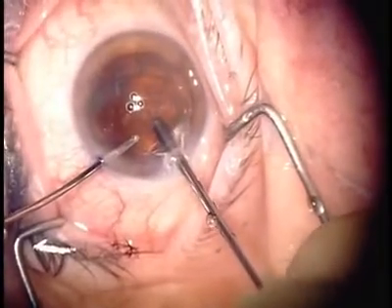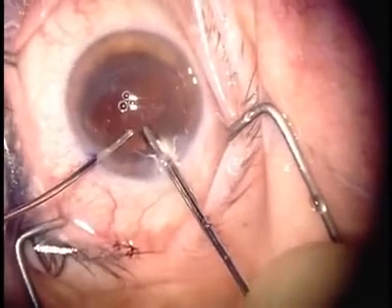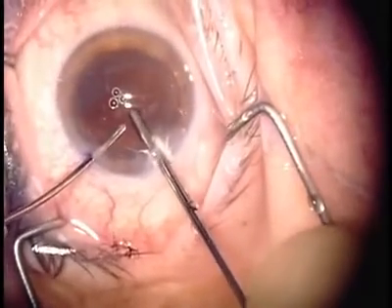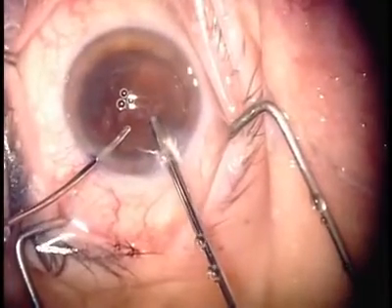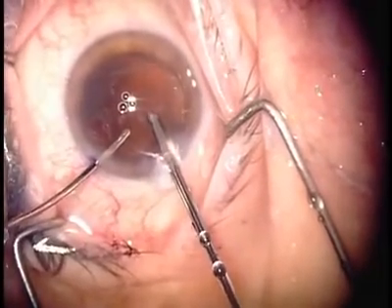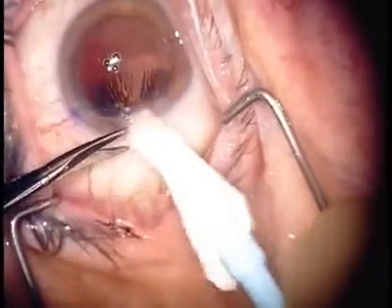It would be better probably at this point to use the paracentesis for the cutter in order to get a better angle at this material. Eventually we transition to the Weck-Cels to get the residual bit of stained vitreous material.